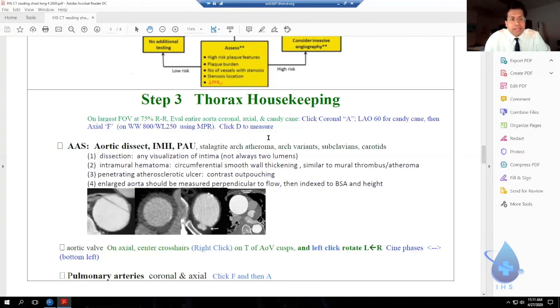And you're justified because cardiac CT is not the gold standard for the coronaries, okay? There is a perfectly famous and good gold standard, which is the cath. But for the aorta and for the pulmonary arteries, the gold standard for pathology there is a gated CT. And you don't get to go to the cath lab. You don't get to order a test. So you have to make your call based on CT. That's why we're going to spend a lot of time on that. And in my reviews, this is where people make mistakes.